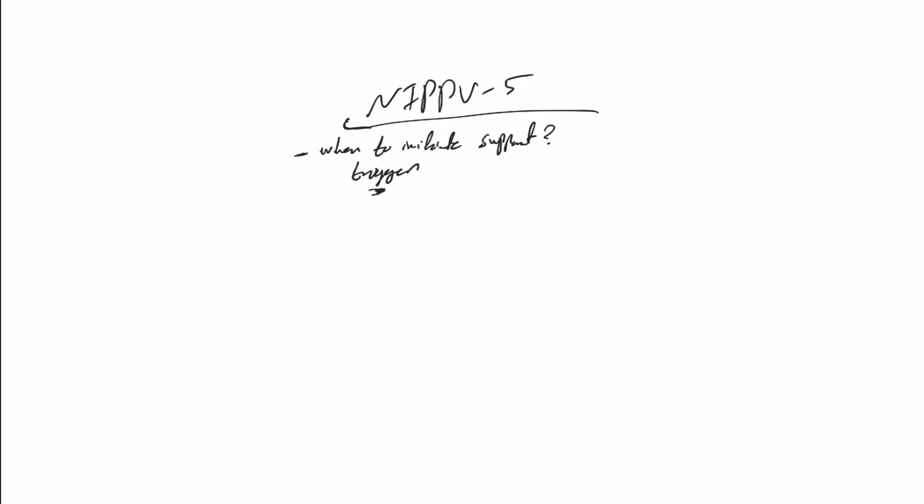Now a trigger in mechanical invasive ventilation, those patients, as you know, are sedated, but we have the patient and machine trigger. So all machines have this capability of the patient and machine trigger. This we call assist, and this we call control. So if the machine, the ventilator, gives the breath, we call it a control breath, initiated from the machine. If the breath was initiated from the patient and assisted by the ventilator, augmented by the ventilator, then we call it an assist breath.